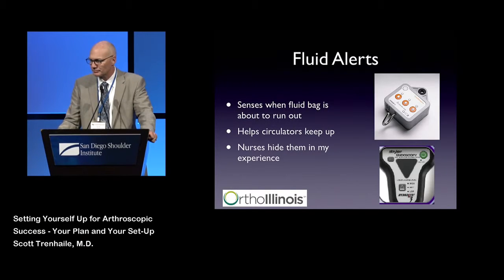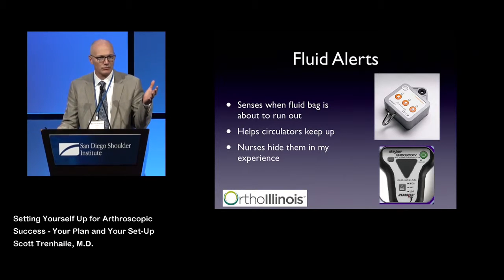There are little devices that are fluid alerts that can be utilized, where it senses when the bag is running out, and that will prompt the circulator to go and get more fluid and hang the bags. I find that the nurses hate these, and they hide them in the closets, so they don't really get used in my institution for whatever reason.